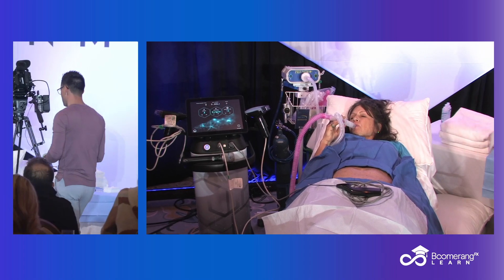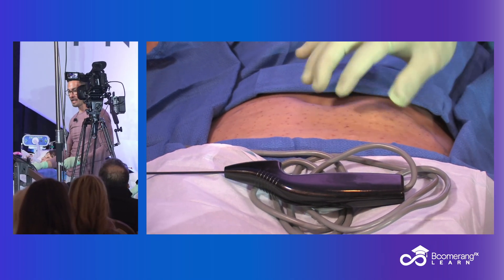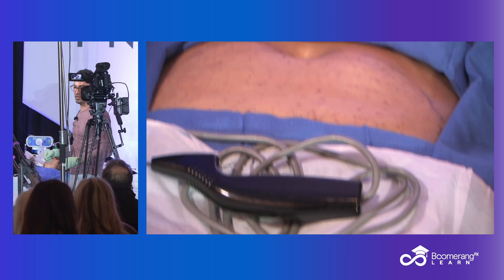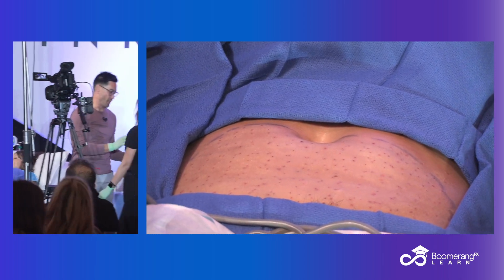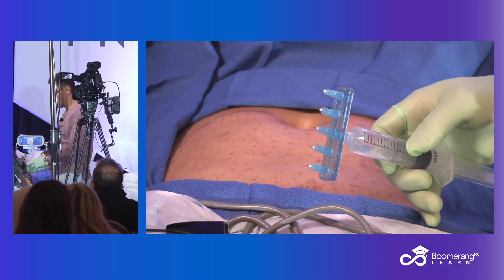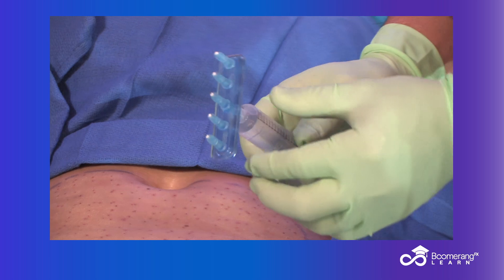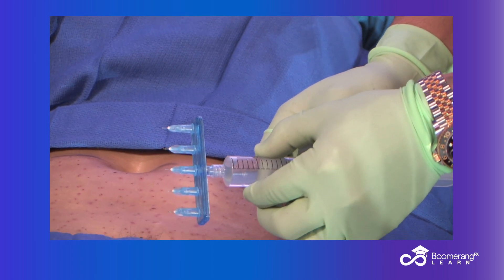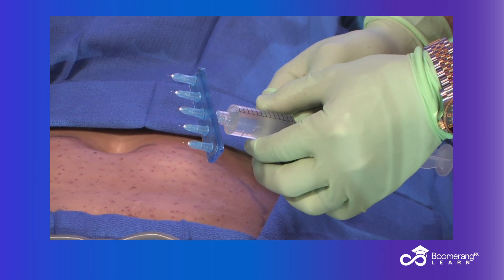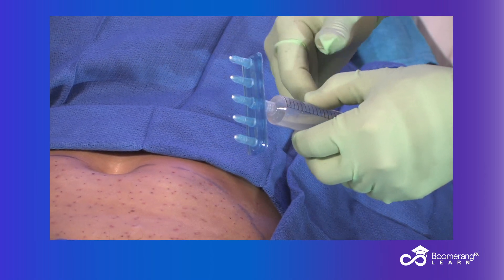And then we apply this — we can zoom in right here, friends. We apply the dilute lidocaine. You can see all the little prickle marks. Savannah used this Meseram right here, and this is an easy way to infiltrate this solution. This comes in a variety of forms — they have circles, which you'll see probably tomorrow, and they have the bars like this. The needles themselves are anywhere from 2, 4, 6 millimeters. This is a 6-millimeter needle, and it's a really weird gauge, like 29 or 31 — weird numbers. But the point is, this allows you to infiltrate a wide area quickly.